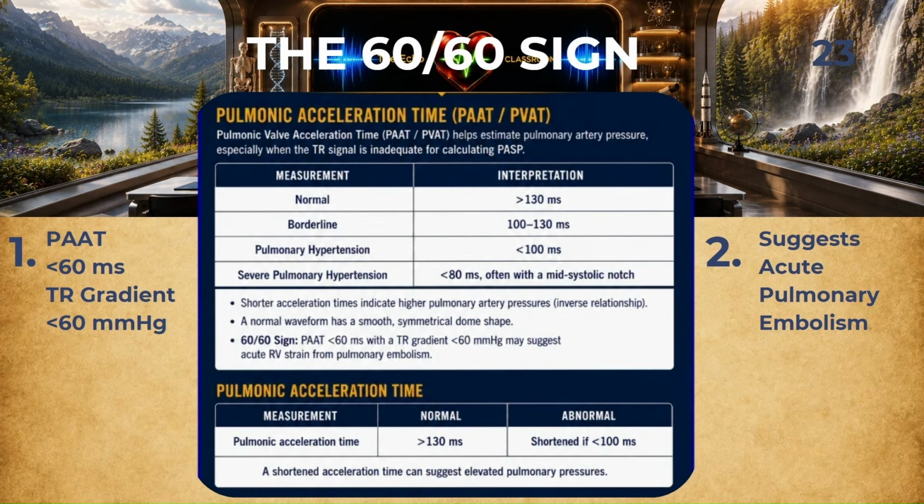The strongest sonographers rarely make assumptions from a single measurement. You should always try to recognize patterns and then put the story together. And that is exactly what the 60-60 sign helps us achieve.